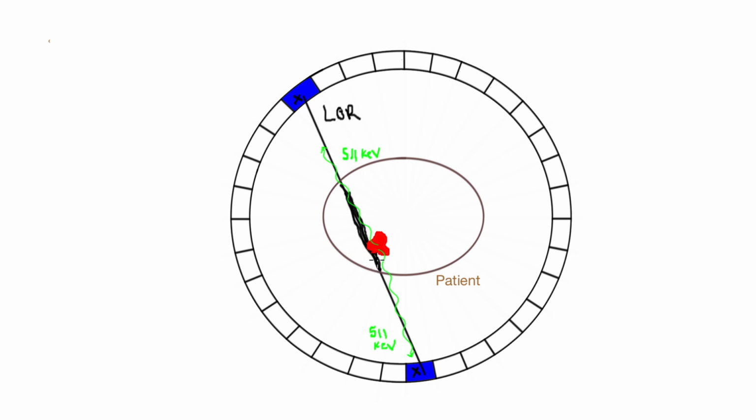And then this is the tomography part of this. So like CT, you're taking different projections, right? When different events come, they give you different lines of response, and you can deconvolve that and reconstruct and figure out what the underlying distribution looked like.